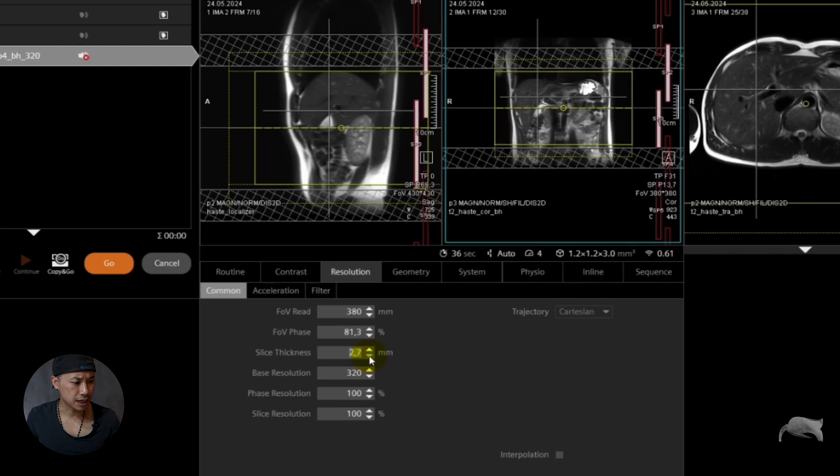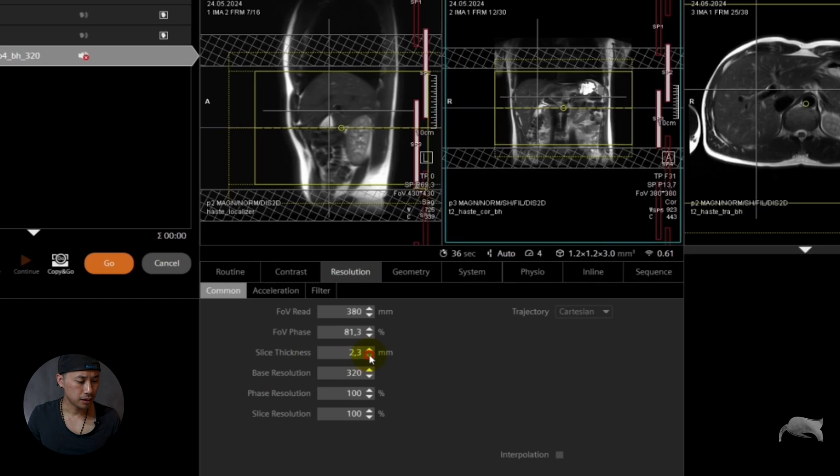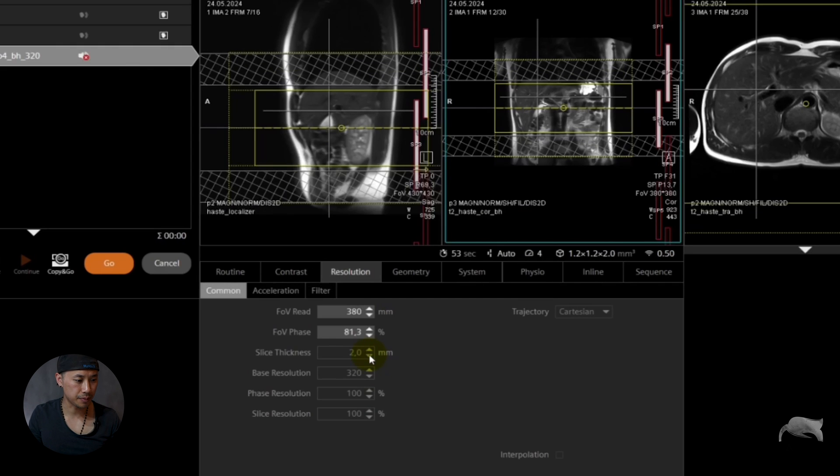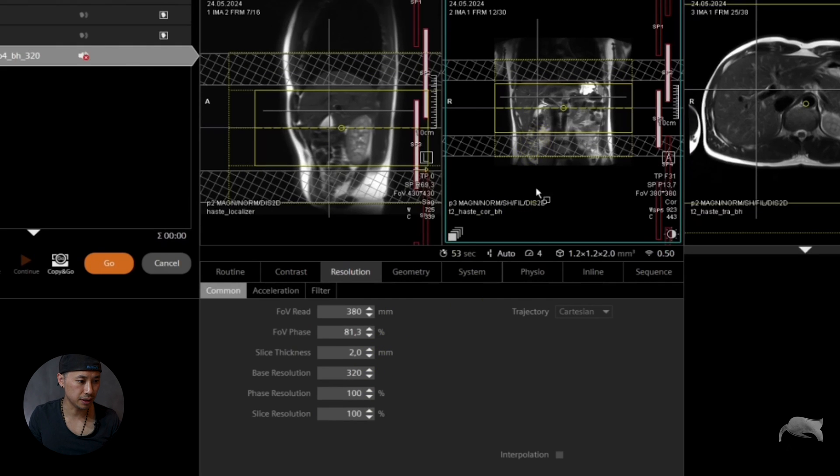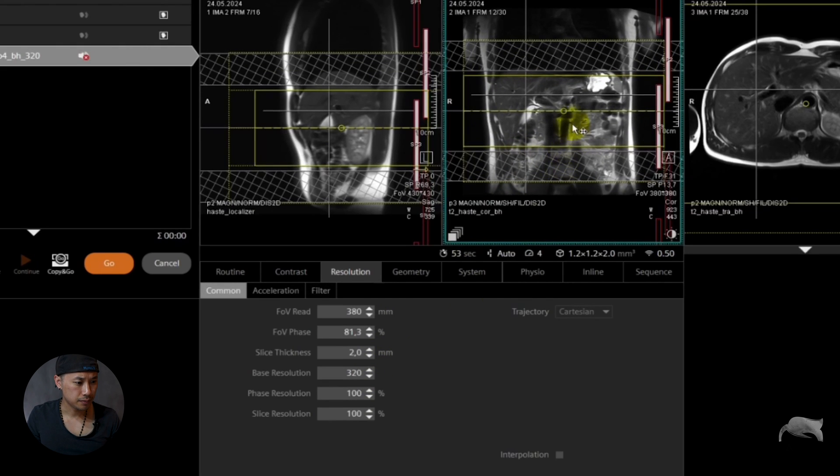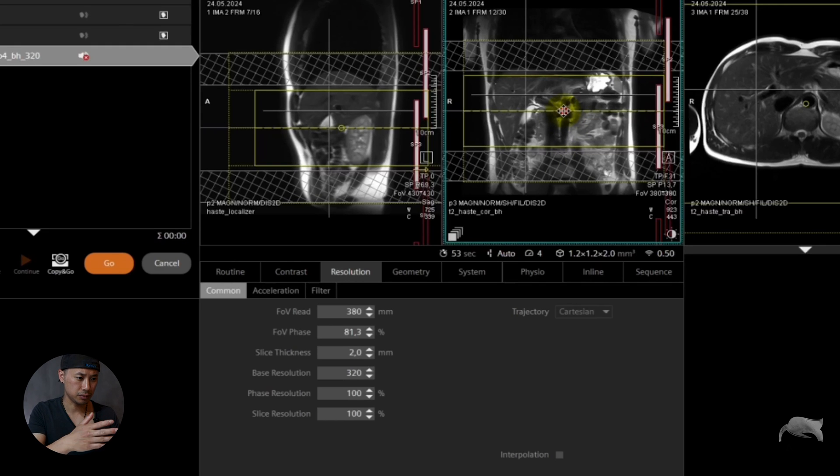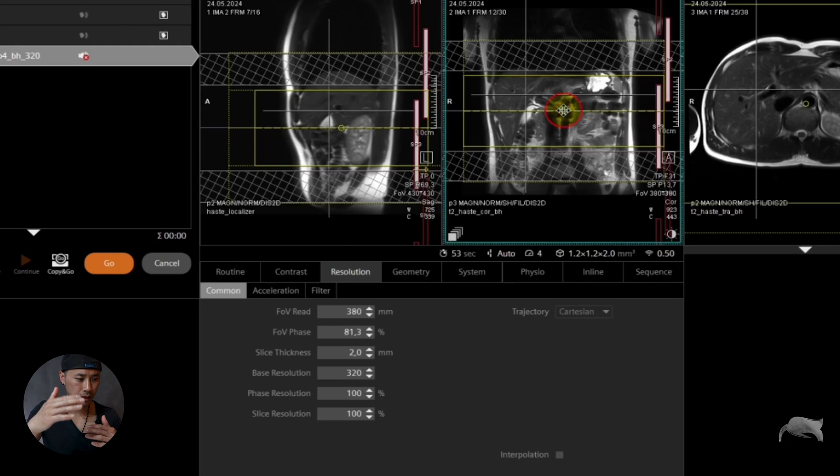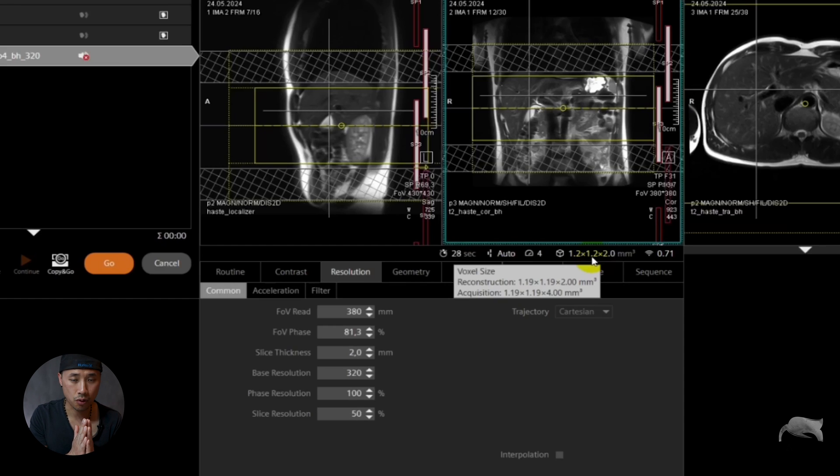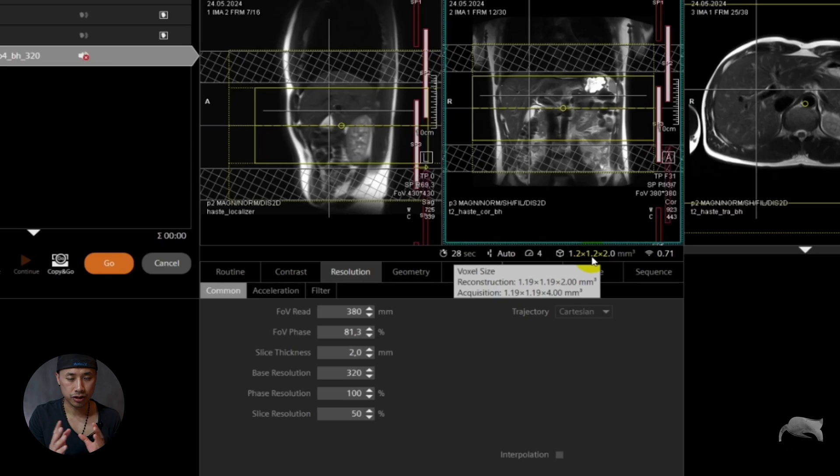So let's go down and slice thickness. Let's choose for example 2 millimeter. If you choose 2 millimeter of course you need more slices to cover the same area from the top to the bottom of the liver. Like that. So we see now that we don't have the whole liver. We are now 2 millimeter and we choose 50%, that means that you are acquiring 4 millimeter and then the reconstruction is 2. So it's good, it's not that bad.